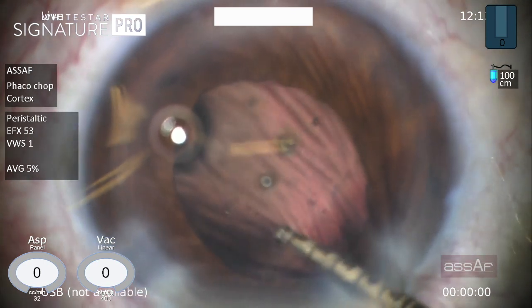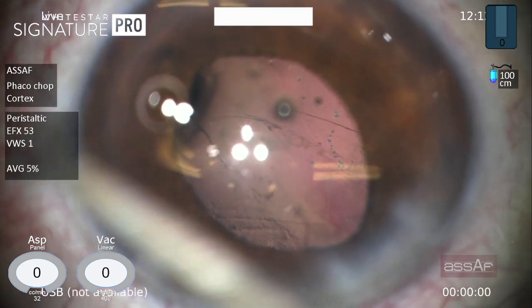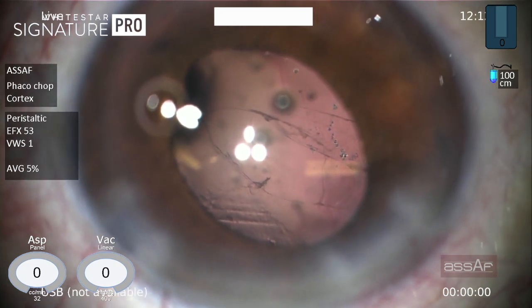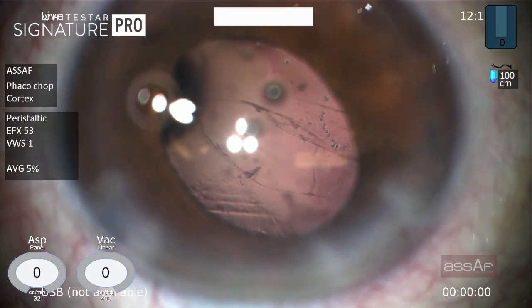Unfortunately, this ends up with a large break. Am I surprised? Absolutely not. I was prepared for this complication.